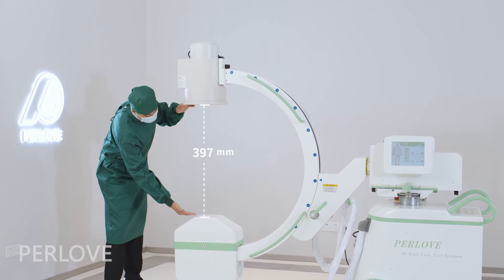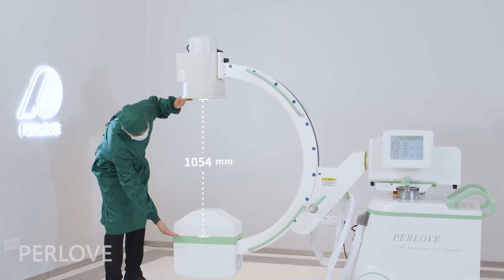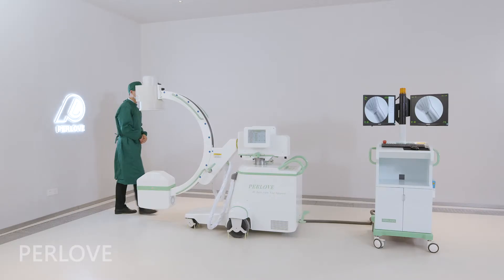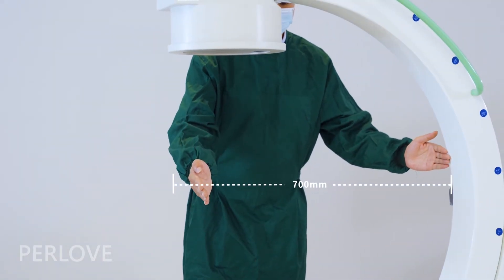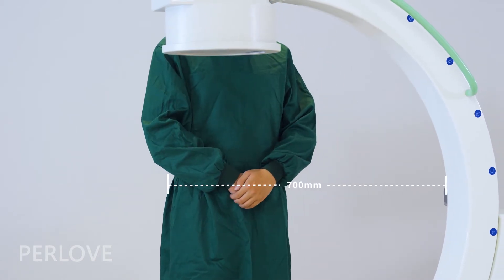The C-Arm opening is 816mm, the SID is 1060mm, and the C-Arm arc depth is 700mm. This gives a suitable operation space.